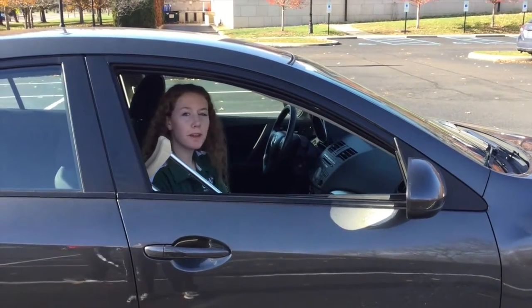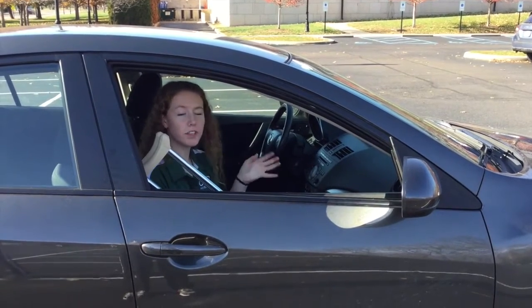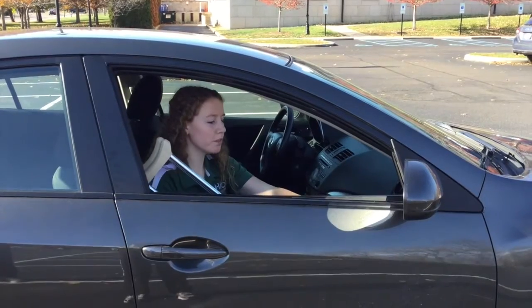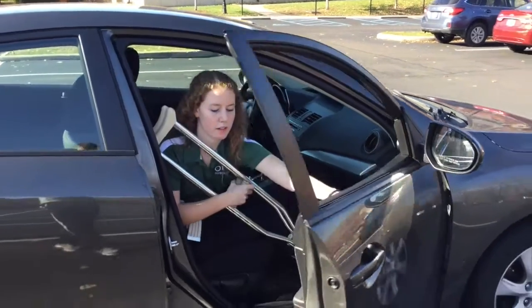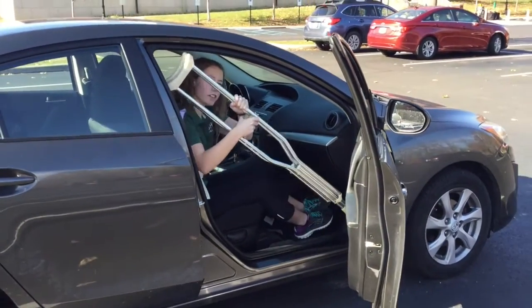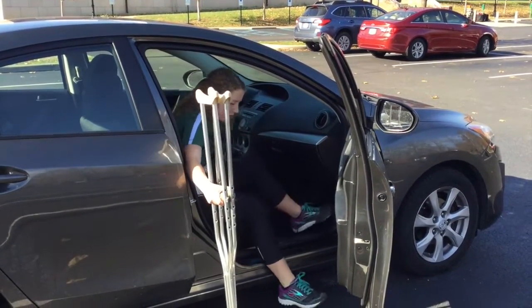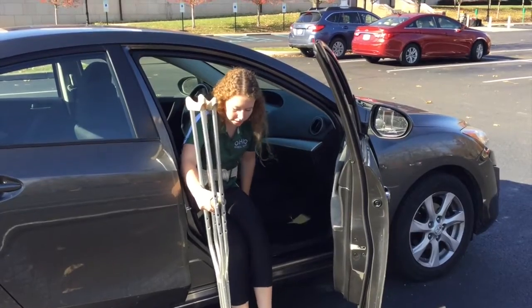Okay, so in order for the patient to get out of the car, they're basically going to reverse the procedure that they use for getting into the car. So first they will open the car door, then they will remove the assistive device from the car and pivot their pelvis and their lower extremities so they are in contact with the ground again.